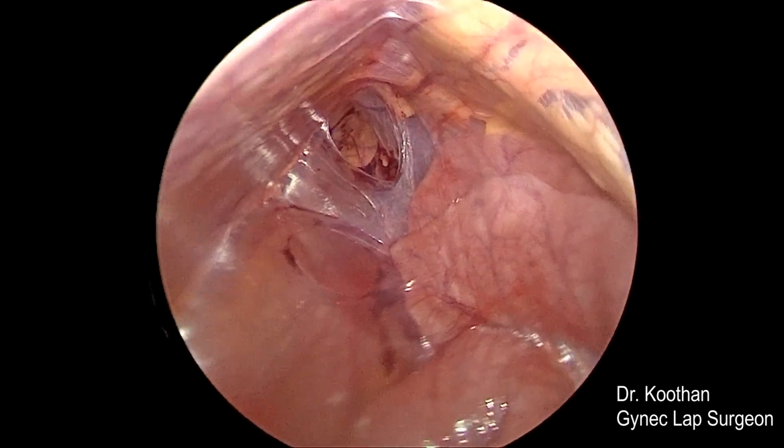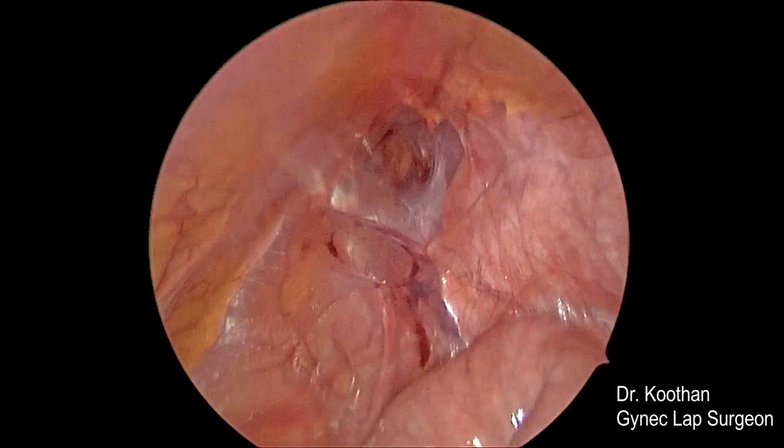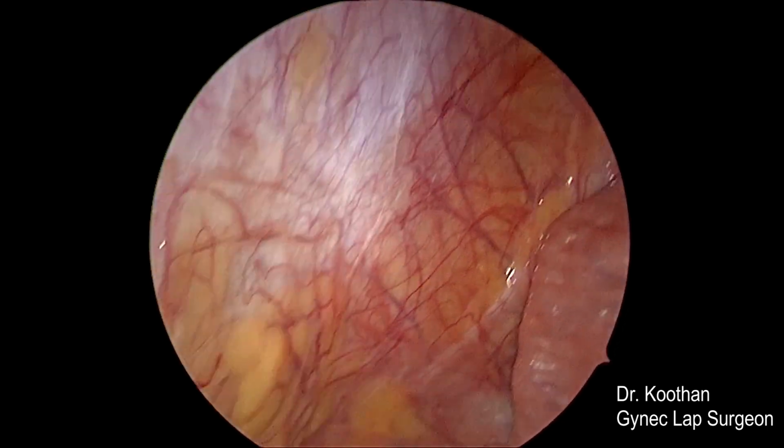So now you can see the bowel loops which are adherent to each other. Now what you are seeing is the anterior abdominal wall, which is free of bowel adhesions. So we are planning to put the secondary trocar in this area.